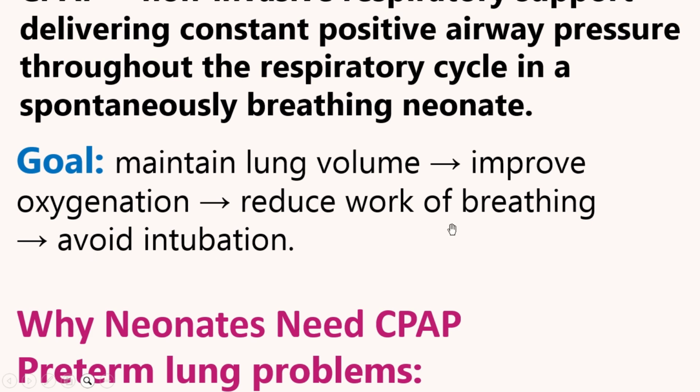And this eventually will reduce the risk of intubation, because remember, if someone has an increased work of breathing, especially a neonate, they're going to use all their energy, they're going to get weaker and weaker, and then eventually they'll start failing to respire. And when they fail to respire, then you have no choice but to intubate them and put them on a ventilator.